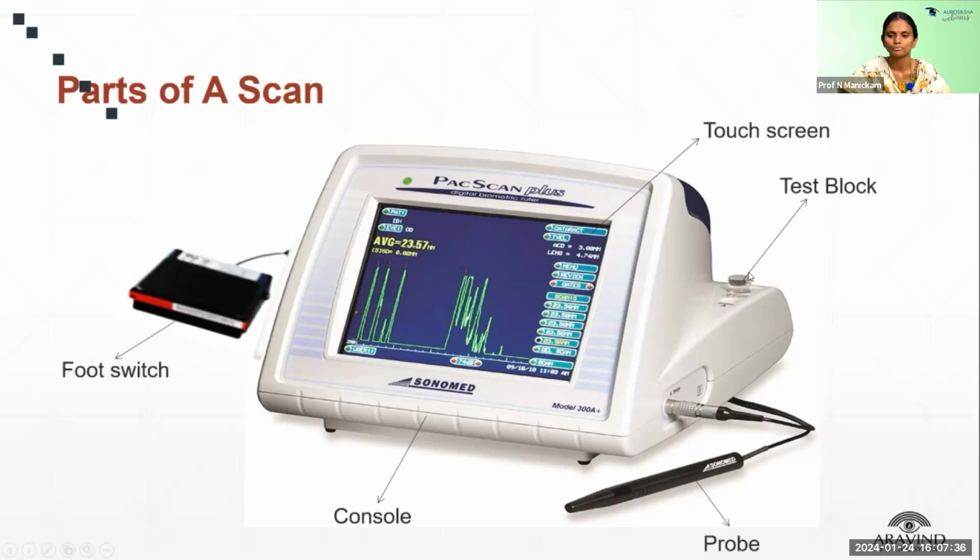Test block: it is for checking the calibration. It is important to ensure the accuracy of the measurement prior to starting the OP every day. Touch screen: it is a very sensitive device. It initiates the scanning procedure. Foot switch: with which we can access the measurement.